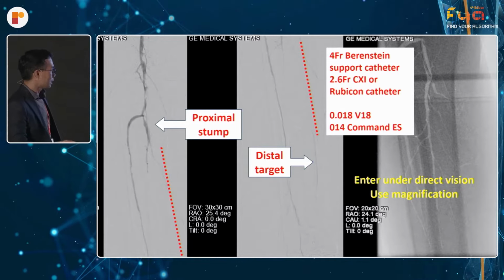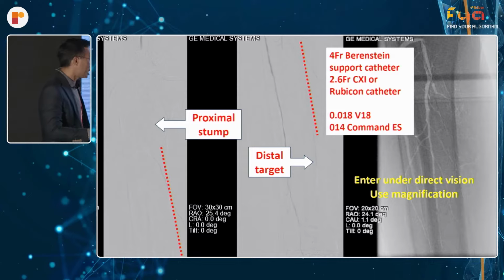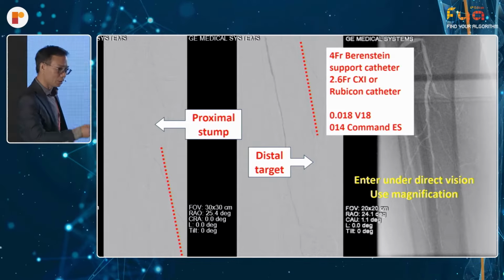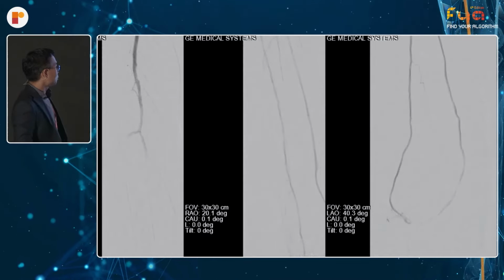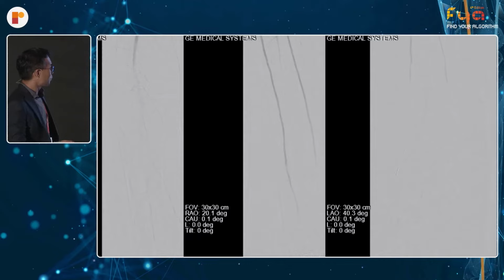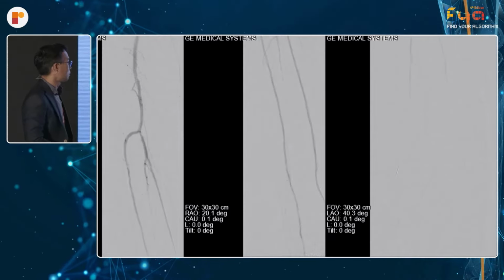Always, for me, enter under direct vision, which means with overlay, and I would use the highest magnification possible so you can see your entry site and your target exit site. So this is the final result of this. This is what you want to achieve, with a nice brisk flow with as little dissection as possible.